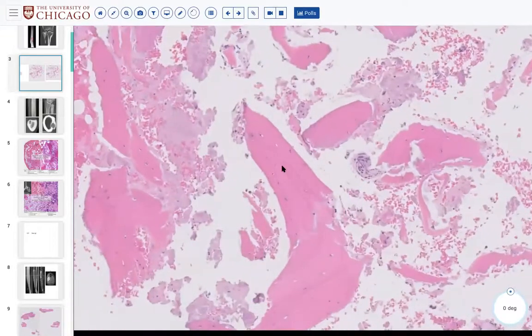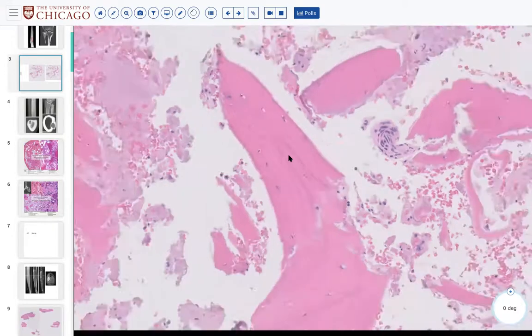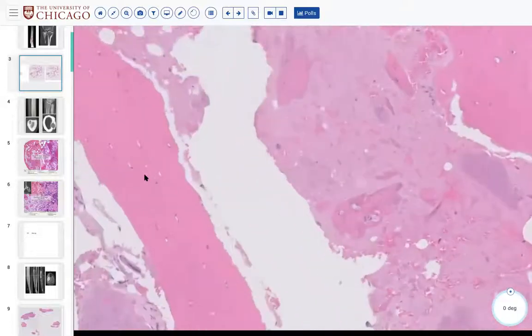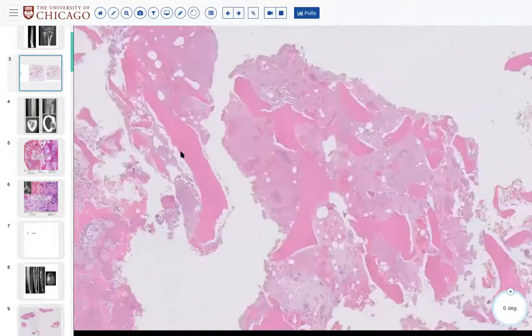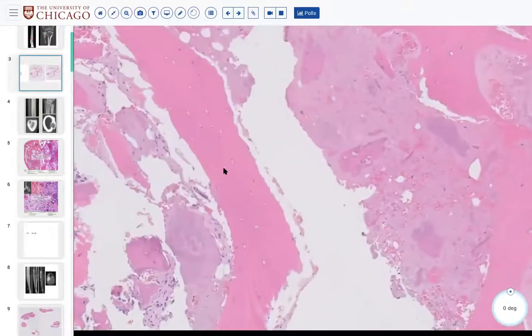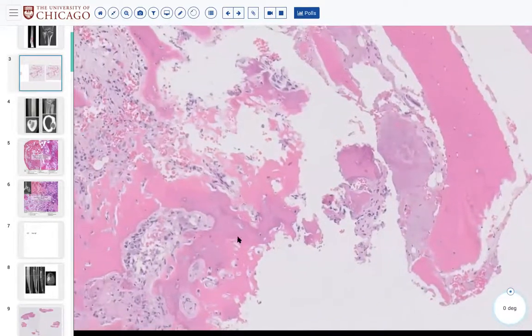Dead bone. Pardon? Dead bone. So how do you know whether bone is dead or alive? It looks like there are osteocytes in the lacunae, so presumably it's alive and well. Correct. Excellent. So it's a live lamellar bone. What does a live lamellar bone imply? Is this the lesion? No, this is not the lesion. Right. Presumably this is some adjacent normal lamellar bone, because most bony lesions produce the bone, and the bone begins as more of an immature type of bone.